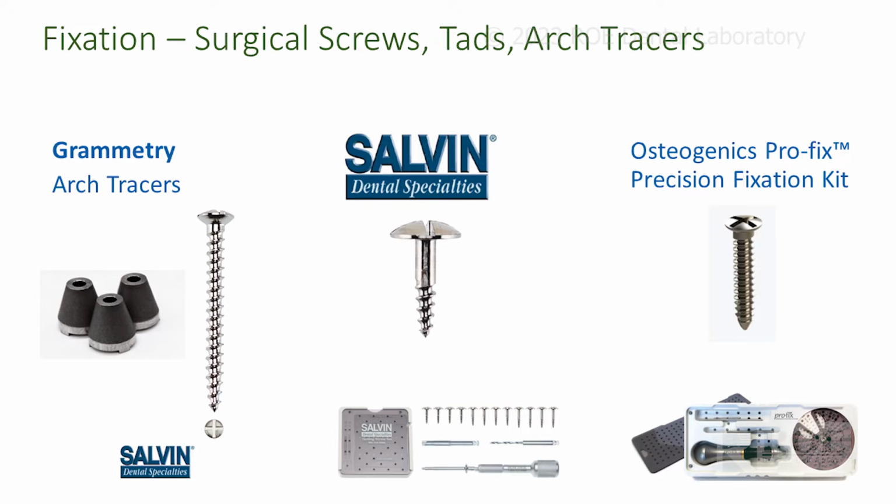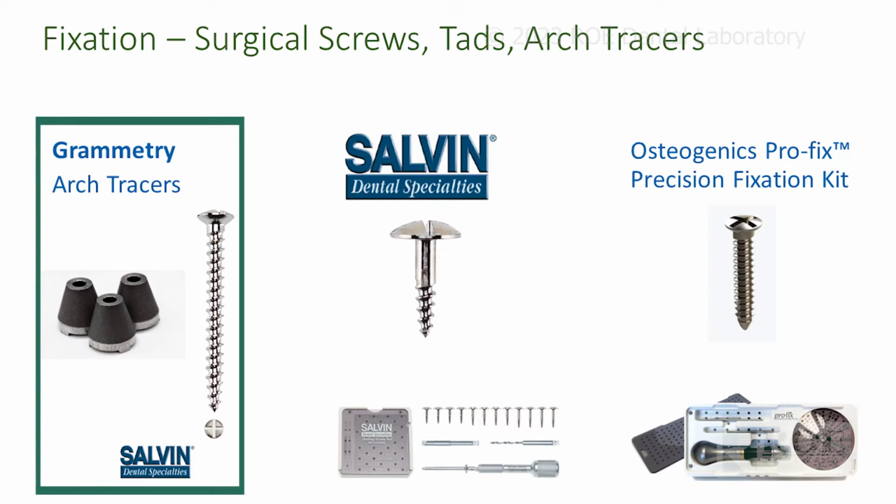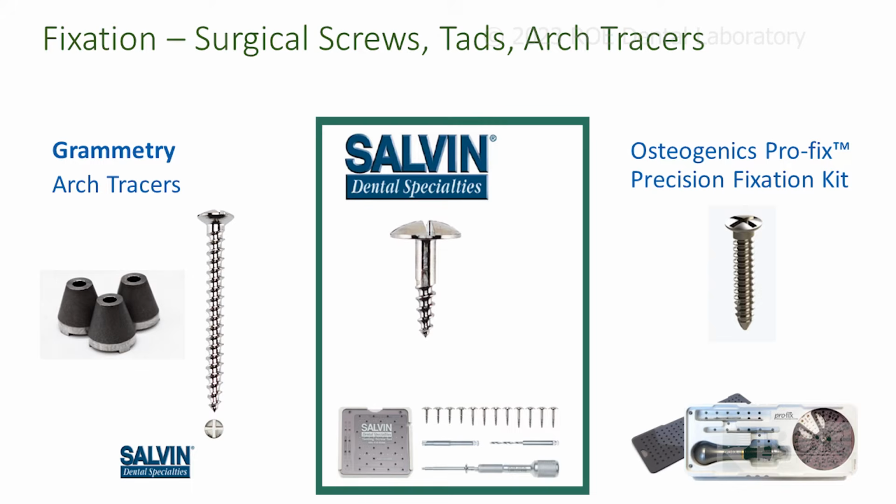Now, these screws or TADs, they can be purchased from several different companies out there. These are three. Don't really sell these too many because it's on a facial, so probably just kind of avoid this image here. You want to purchase a screw, which would be a short, wide one from Salvin, which is nice.